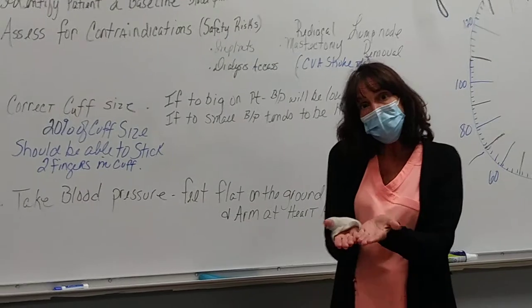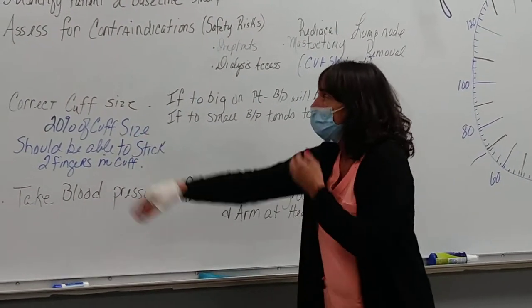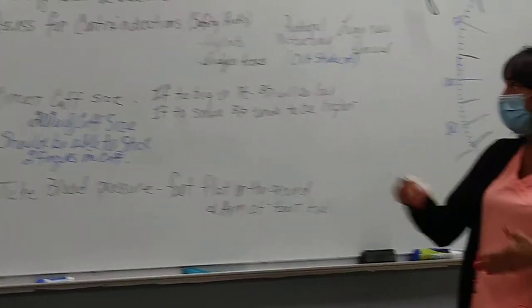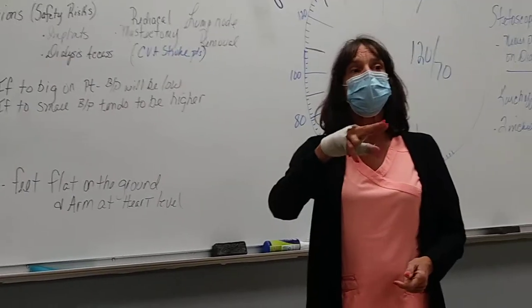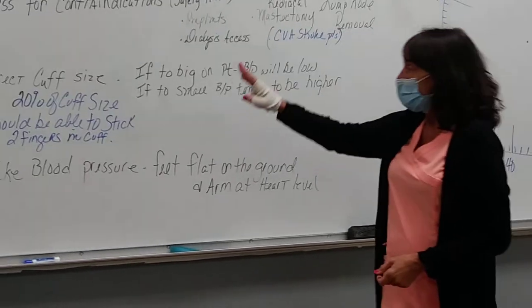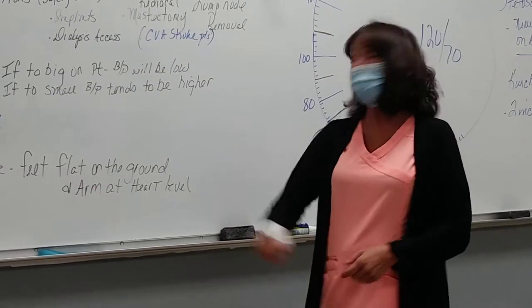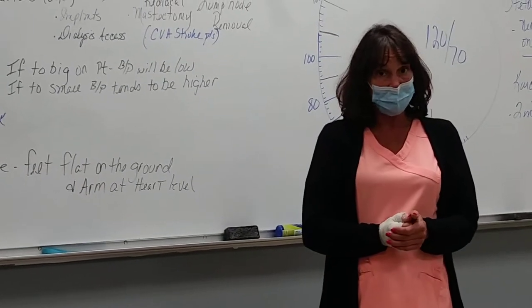When you wrap a patient in their cuff, and we'll show you how to do that as well, 20% of the cuff size should be able to stick out, and you should be able to put 2 fingers into the cuff, and that is a proper fit. Have your patient sit, arm at heart level, and feet should be uncrossed and flat on the ground.